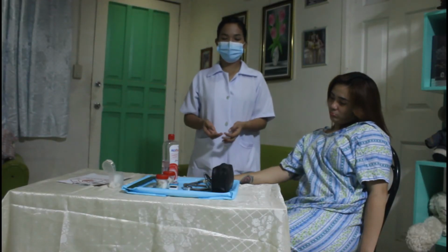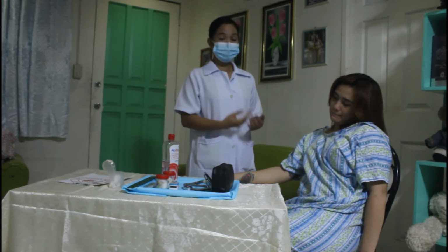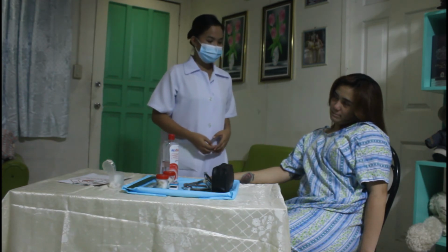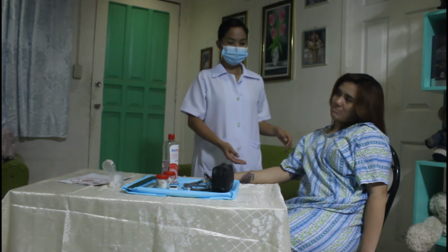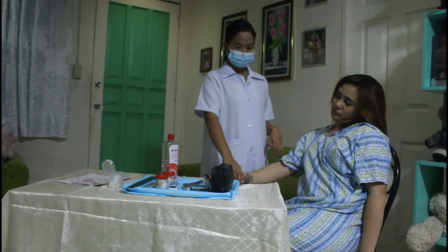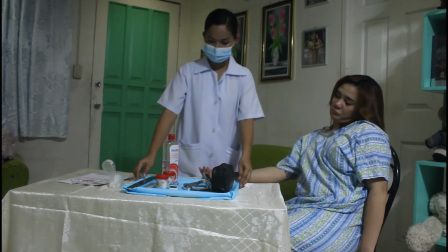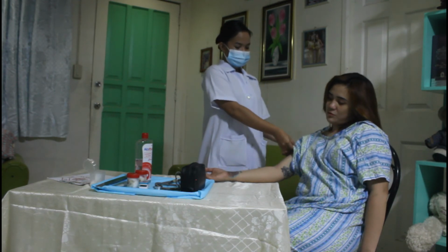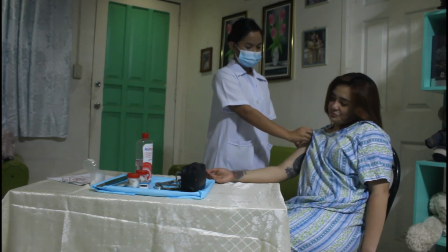So once we're done with getting her oxygen saturation, then we now proceed to the last vital sign taking, which is the blood pressure of our client. So we position our client in a comfortable position, which is sitting position, with her forearm at heart level or at a relaxed position, then turn palm up. Then we pull up the sleeves of our client to provide privacy to her arm.